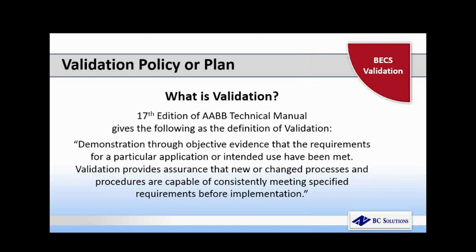And this is an elaboration of the definition of software validation in the FDA guidance document, which states that software validation means confirmation by examination and provision of objective evidence that the particular requirements for the software's intended use have been consistently fulfilled. So what they're saying is that validation is more than just testing your system, verifying that the functionality works or that your tables are set up correctly. It is verifying against a set of requirements that your system performs appropriately.